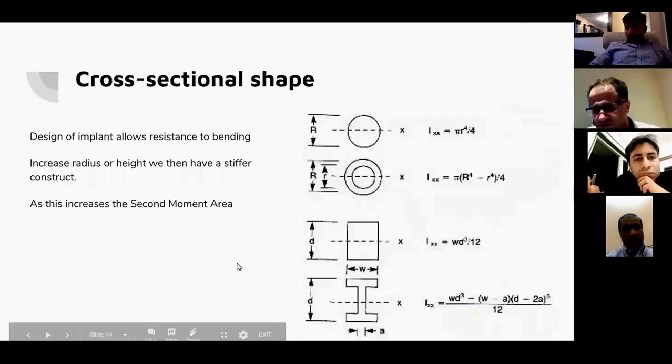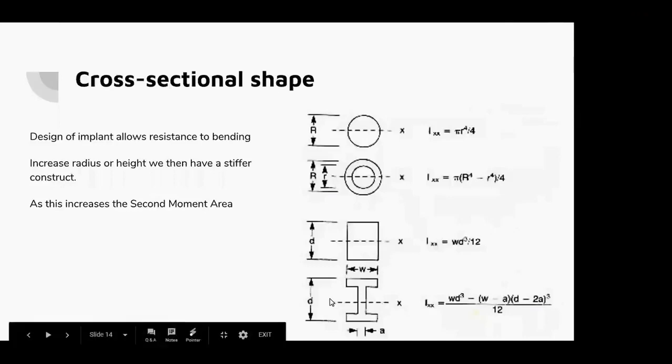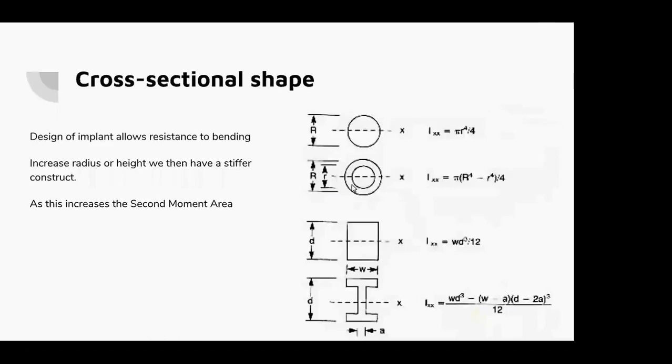The girder itself, you're still preserving the height of your plate. But what you're doing is using less metal. Therefore, you have a lighter construct. And it's an important concept to remember, because you're maintaining the width of your construct, you're maintaining the height of your construct, but using far less metal in that process. The same principle as your hollow nails.